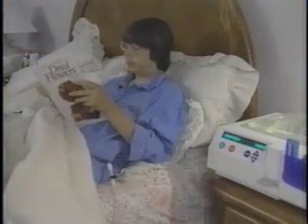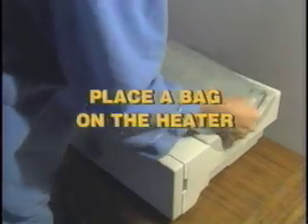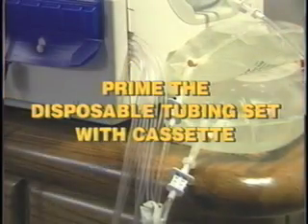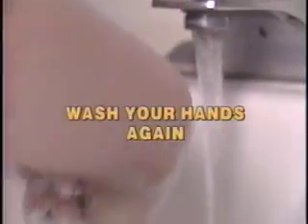To get started, here is a quick review of the main steps to begin therapy. Mask and wash hands. Prepare your supplies. Place a bag on the heater. Load the disposable tubing set with cassette. Attach the drain bag or drain line extension. Connect the bags. Prime the disposable tubing set with cassette. Wash your hands again and connect yourself.